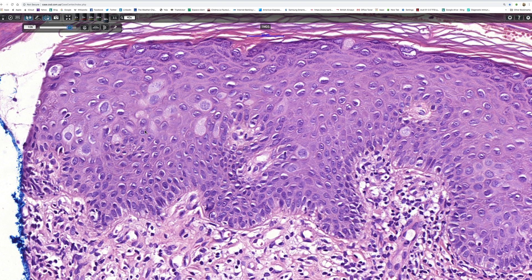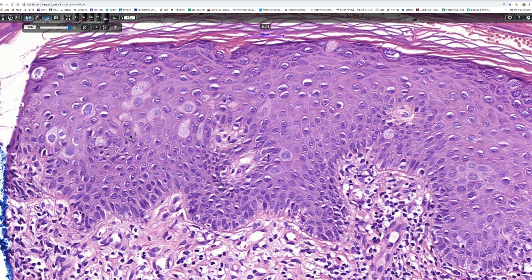Nucleoli are not really evident. When we look at this, we have to think of what differentials come to mind, and I think there are four entities. One is extramammary Paget's disease. Secondly, Pagetoid Bowen's disease. Thirdly, superficial spreading or Pagetoid melanoma. And fourthly, if this biopsy had come from the perianal region, one might have thought of Pagetoid dyskeratosis.